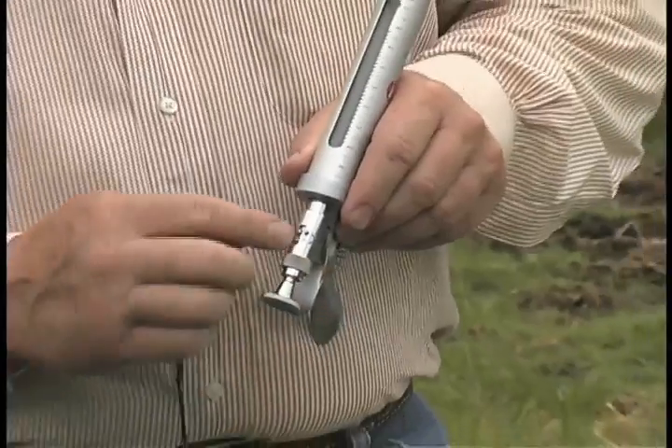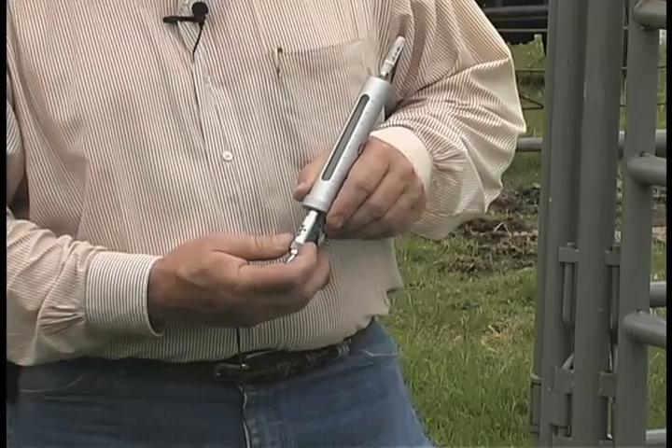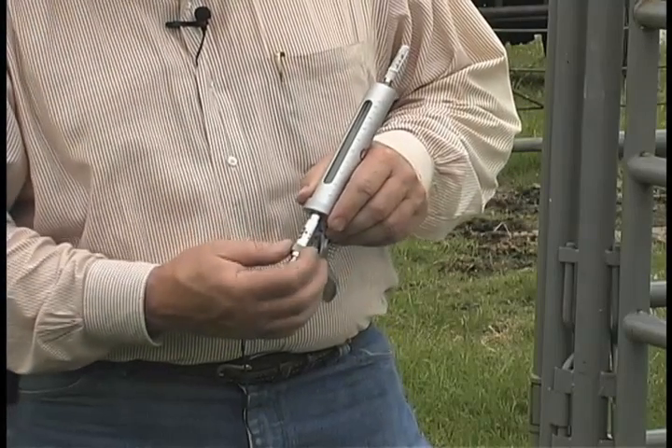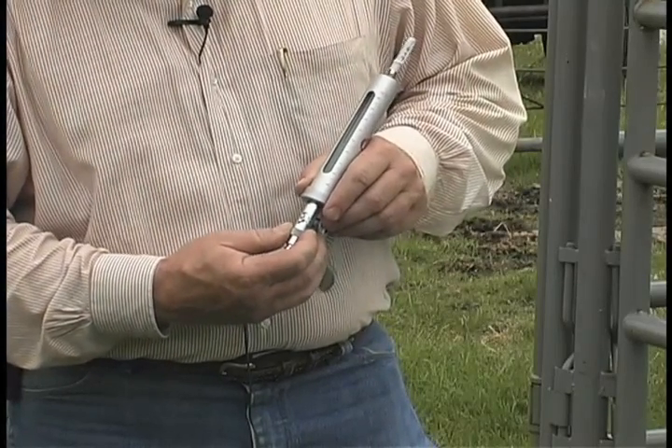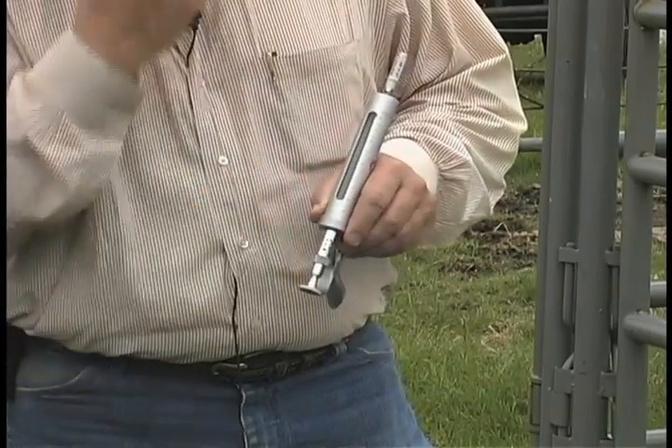You need to check this gauge periodically — recommend between every animal — to make sure that you're not over or under dosing, and that the gauge has not gotten knocked loose, so that you're delivering the proper amount to the animal.